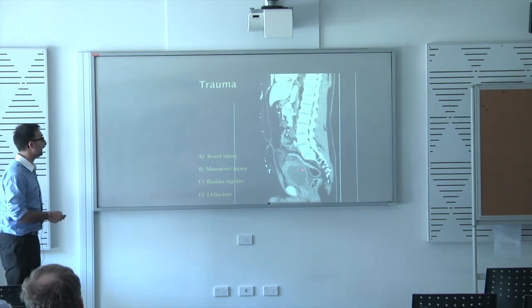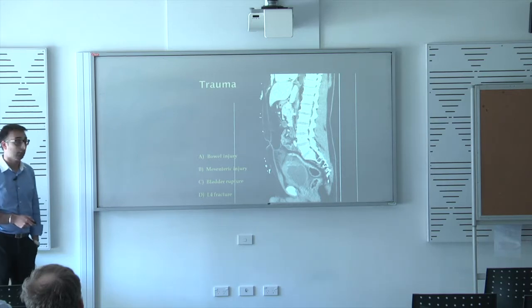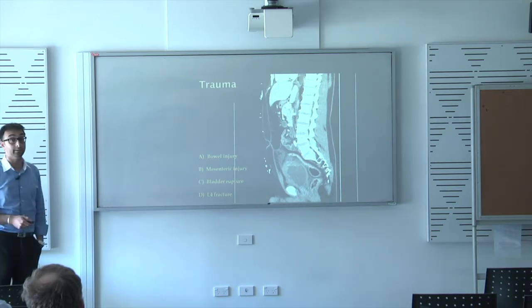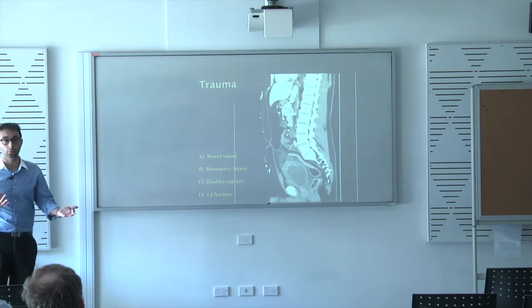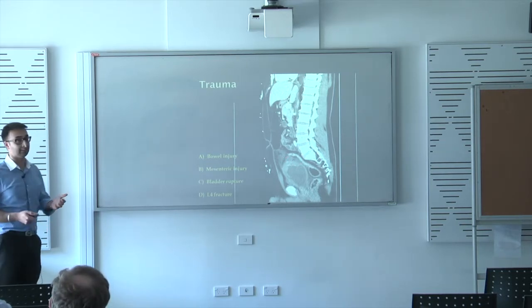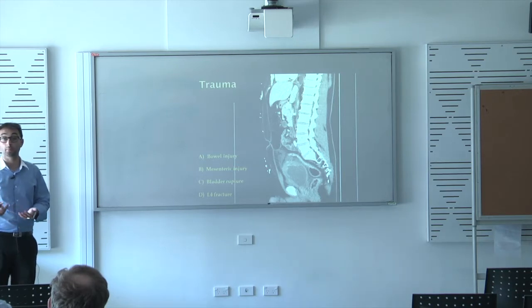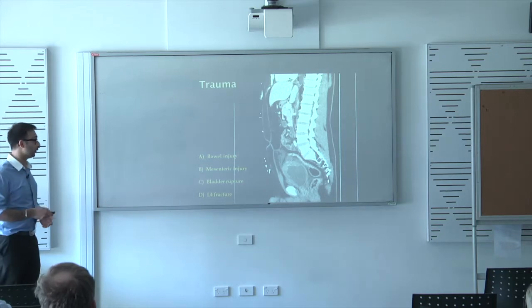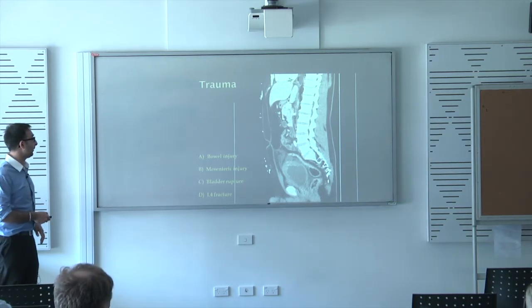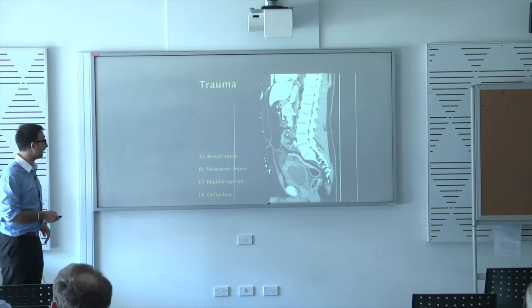But what you can see is that the bladder is really abnormal. It's really thickened, it's heterogeneous, and a normal bladder doesn't look like that. And if you've got fluid in it, it should be very thin-walled. You can't really assess the bladder wall on CT, but that's very abnormal. And there's all this fluid around it. It does raise the question, is this actually a mesenteric injury if you've got fluid within small bowel loops, or is it a small bowel injury? With a small bowel injury, what you'd ideally see is locules of gas. And the L4 fracture is just to put you guys off.